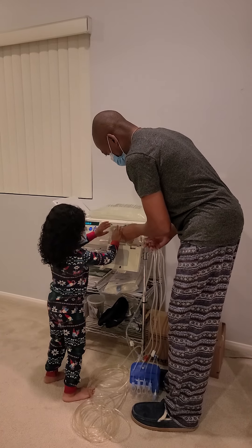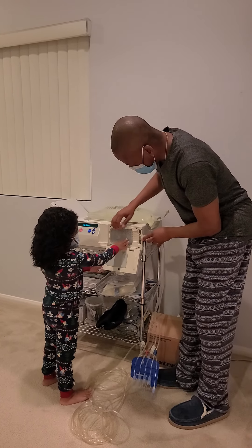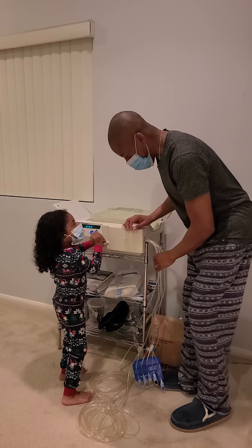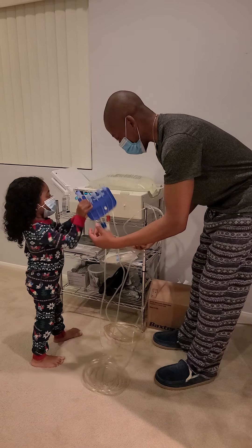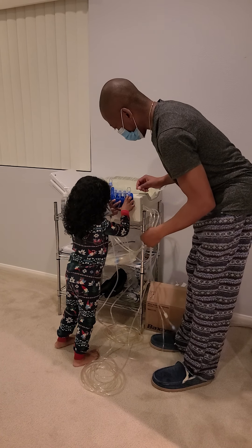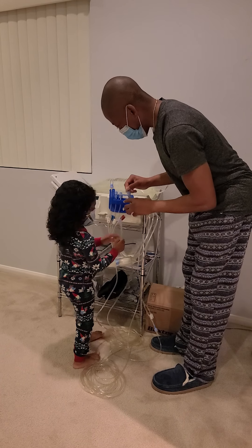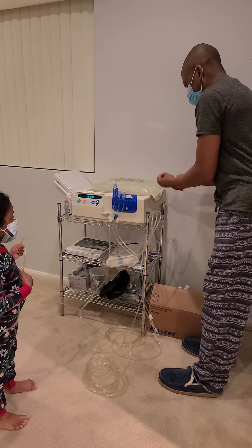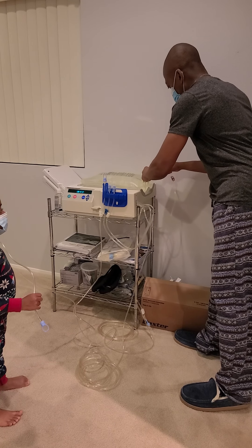Let's put that in. Let's close the door. And we've got a special way to do this where we pinch here and we pull, twist and connect.